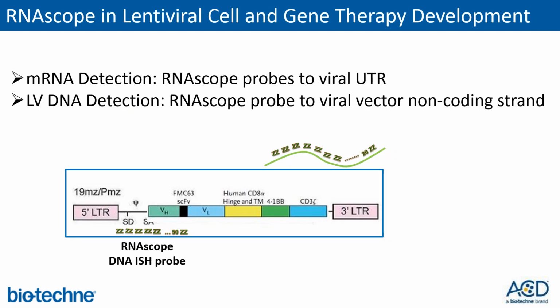RNAscope is also being put to very good use in lentiviral-based cell and gene therapies. I speak at much greater length about CAR T-cell and TCR T-cell applications in a different presentation. Here, I will just use a few slides to illustrate its use for detection of lentiviral DNA sequences.